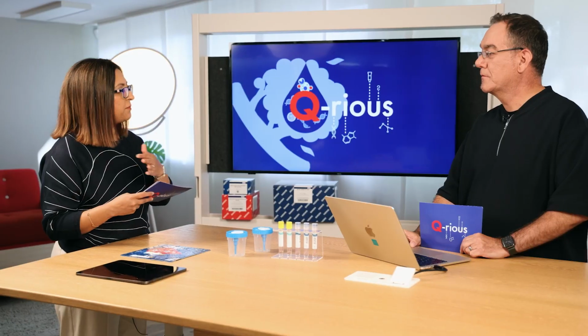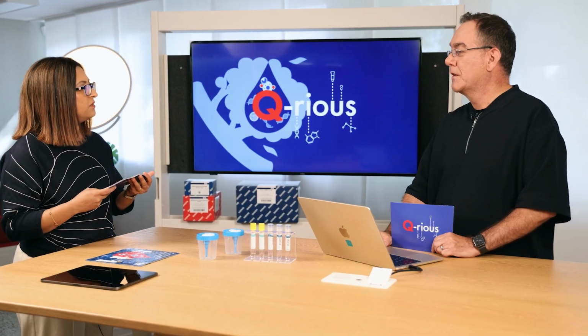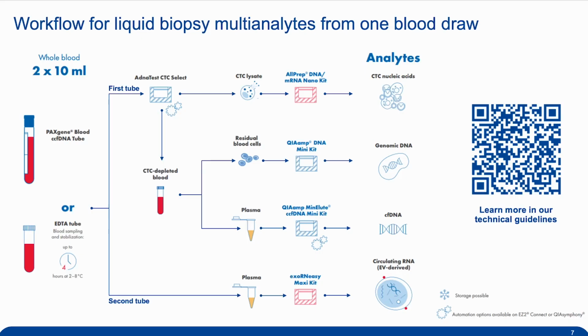Okay. And so that's all about stability. And in this workflow, as I understand, do you have to do all of the steps immediately, or are there really stopping points at any part of the workflow? Yeah, that's an important question, because many workflows you have to do in parallel, but there are really easy stopping points. For example, in the CTC workflow part, you can freeze the lysate as soon as you have selected the CTCs and lysed them.